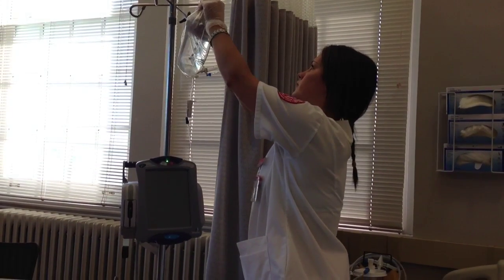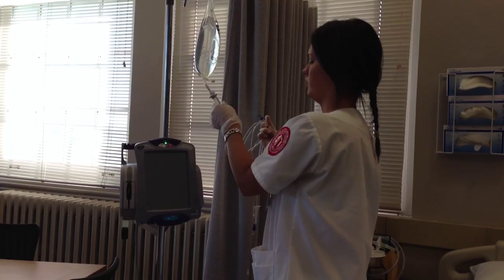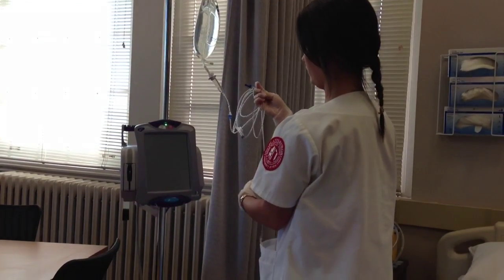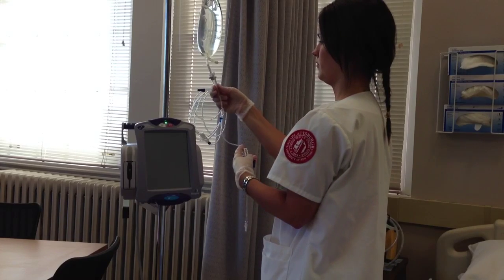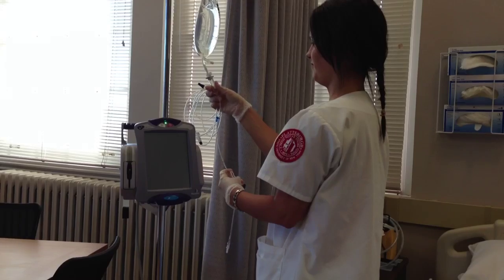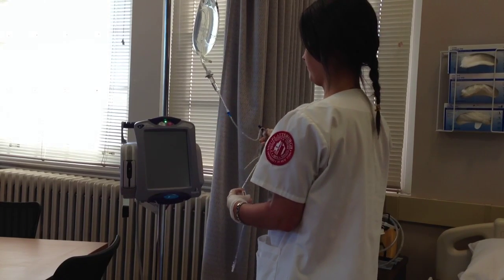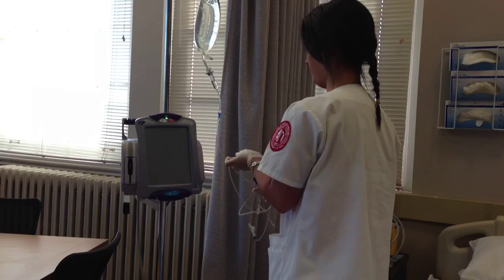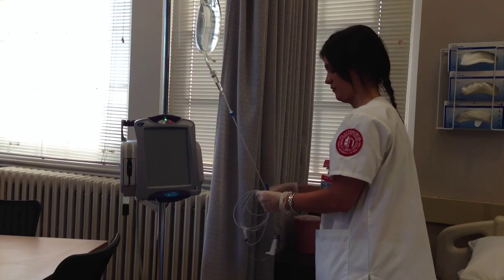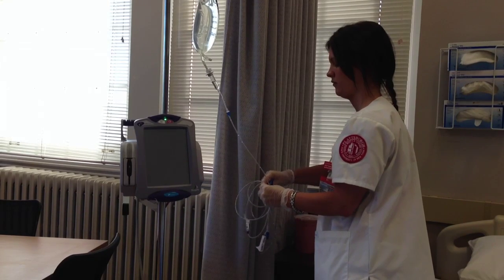The easiest thing to do next is to hang the bag up so that you have both hands to work with the tubing. Once the bag is hung, you're ready to prime the line. You're going to do this by filling the drip chamber, opening up the clamps, and running the fluid through the line. Make sure to invert the ports to get all of the bubbles — or as many as possible — out. Fill the drip chamber about halfway with fluid, then open up the clamps so the fluid from the bag runs through the line. Make sure to remove as many air bubbles as possible.